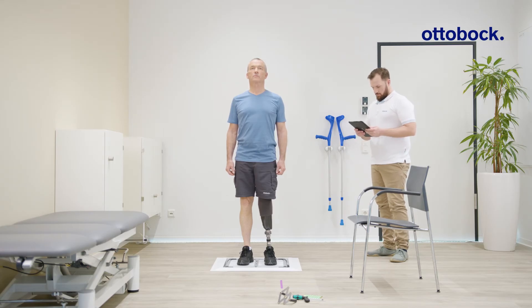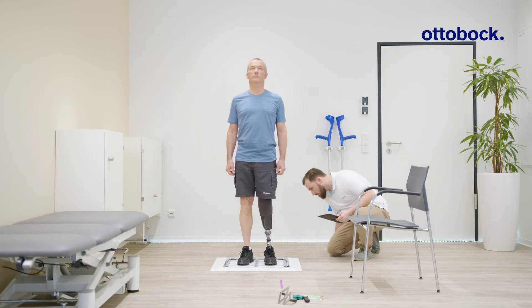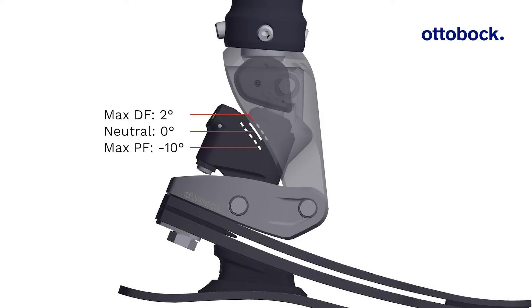The recommendation for static alignment is that the user should feel balanced from front to back. Additionally, check the angle indicator lines. The lines should show that the ankle is in the neutral position and that it is not at the dorsiflexion or plantar flexion stop.